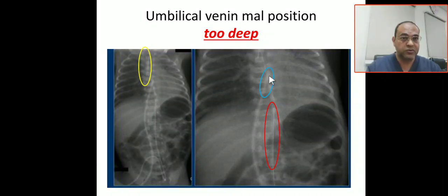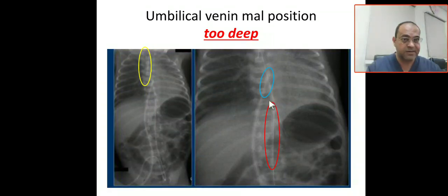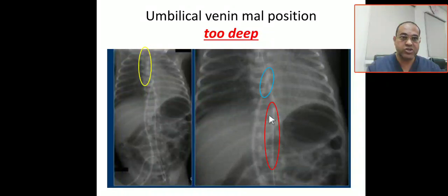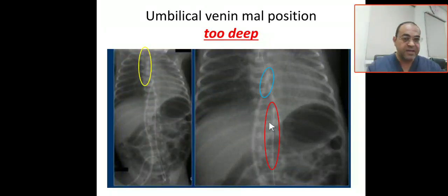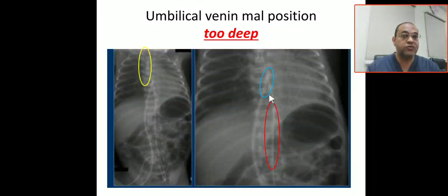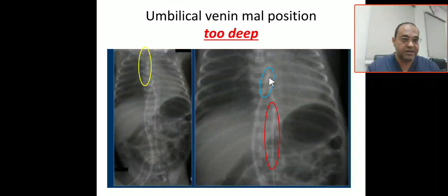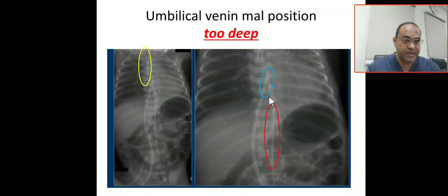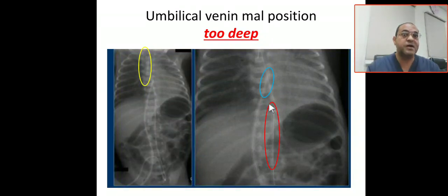Looking at the umbilical arterial catheter, it is also not in the proper position. It is at T10, but it should be between T6 and T9 — above the diaphragm. So this is an abnormal position for the umbilical arterial catheter.